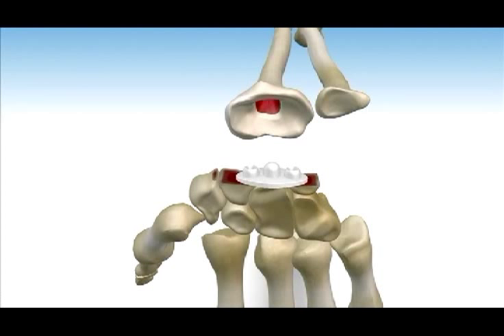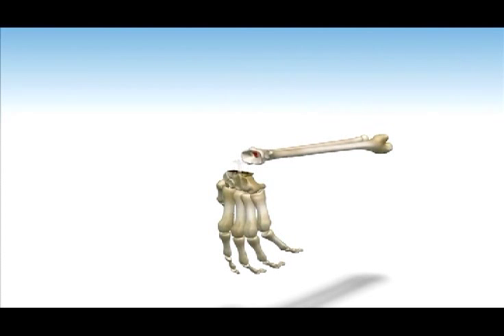Step five. If the pilot holes for the screws were not prepared using the PGT carpal template, they can be prepared using the carpal trial and the PGT metacarpal drill guide. This can be accomplished using the same method described earlier. Remove the trial components.